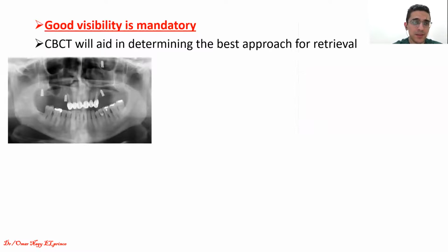And of course CBCT. It's not all about CBCT, but you will have CBCT. For an image like this, if you get a panorama like this, the first thing you will think is that the implant is in the eye. It has migrated to the eye, which is very rare. An implant can migrate to the eye after migrating to the sinus lift, but it's very rare for it to actually migrate to the eye.